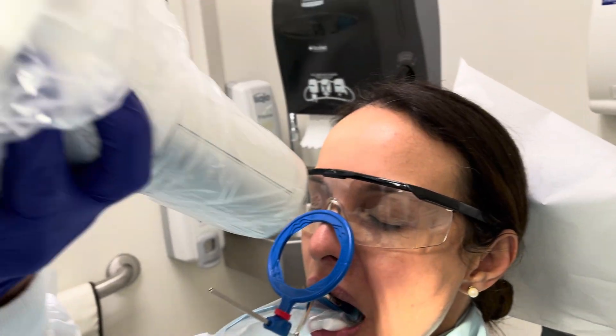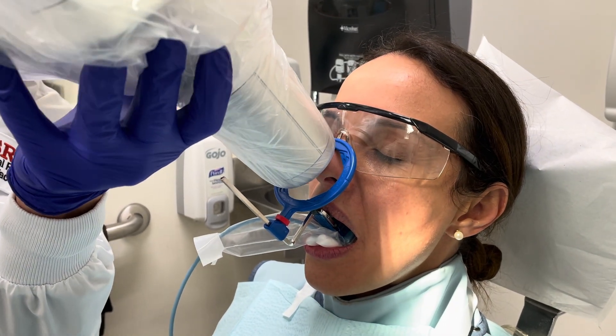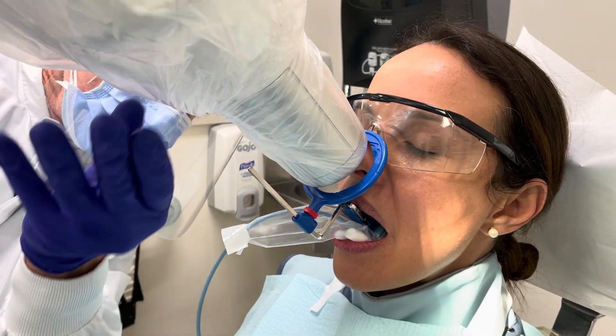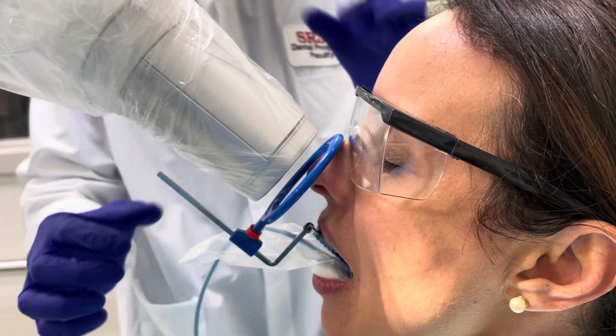Then we line up, and it can be up to about a centimeter or so apart. I'm checking from all angles. We're going to go to the next image.